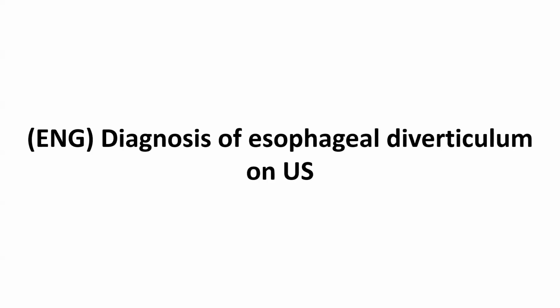Hello. In previous videos, I've explained the ultrasound diagnosis of esophageal diverticulum on several occasions. However, I've received feedback that it is still not easy to diagnose for beginners. Therefore, I've structured this new video to be more specific and easier to understand.